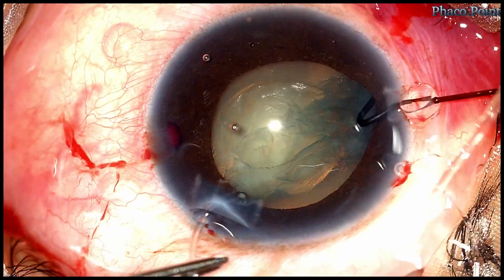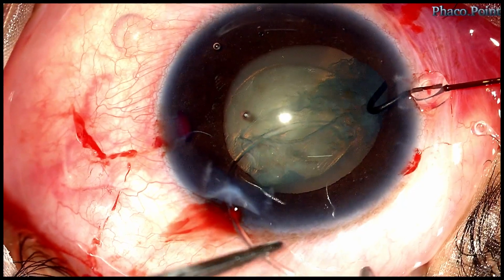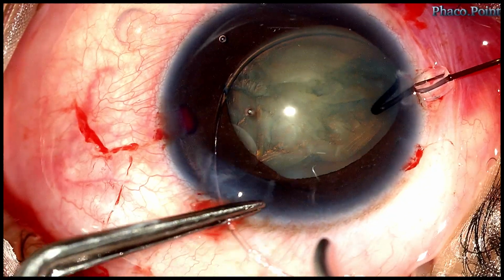Having stabilized the capsular bag, I now proceed to introduce the CTR into the capsular bag with a hand-on-hand maneuver with the view of achieving an equatorial stability of the subluxated cataract.